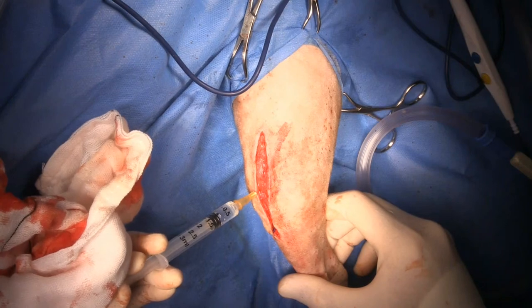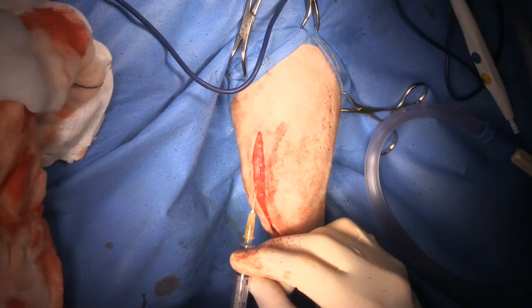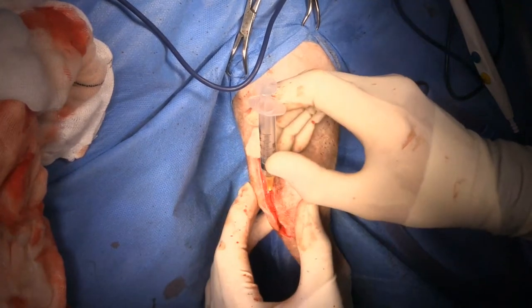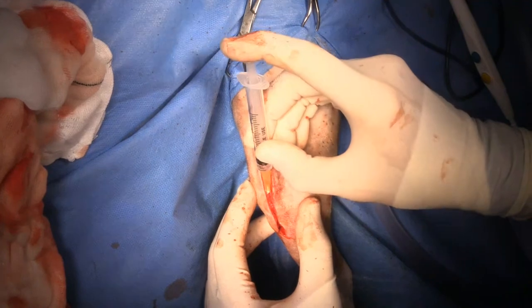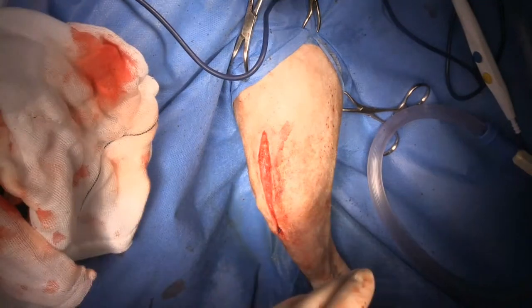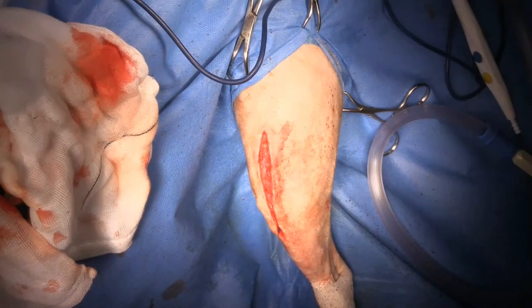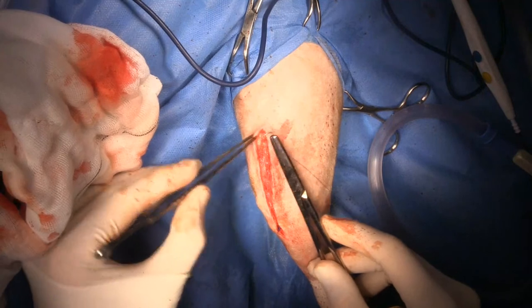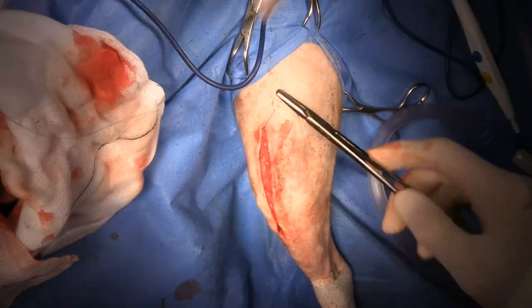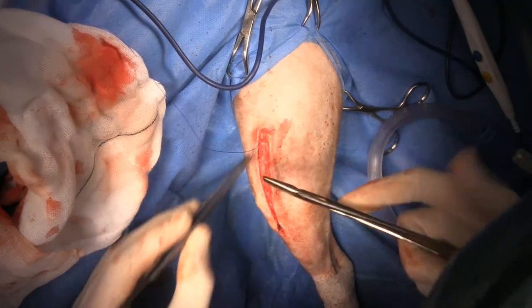I've made my repair too watertight - the mepivacaine is supposed to leak out into my fascial incision. We did a nerve block as well, but since this dog was light during the anesthetic I'm concerned it might not have taken, so that's why I'm doing the intra-articular block as well. I'm going to do everything I can to have a local anesthetic providing the majority of pain relief post-operatively, because it's more effective and has less systemic effects. Now I'm just doing an intradermal suture pattern.